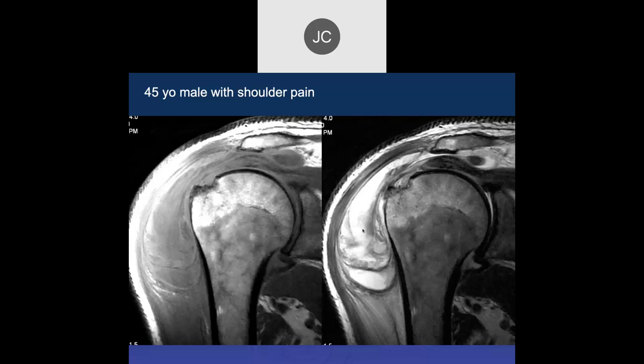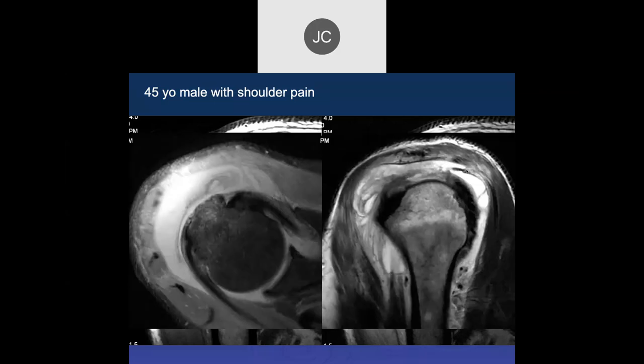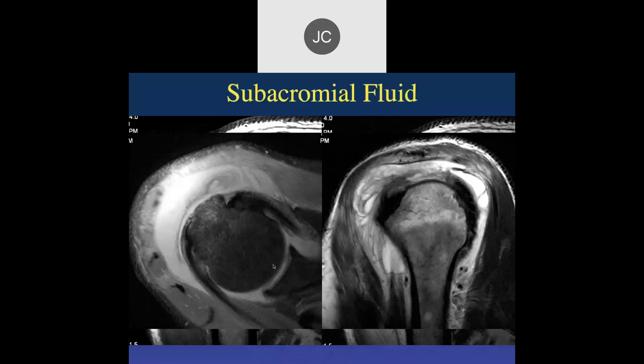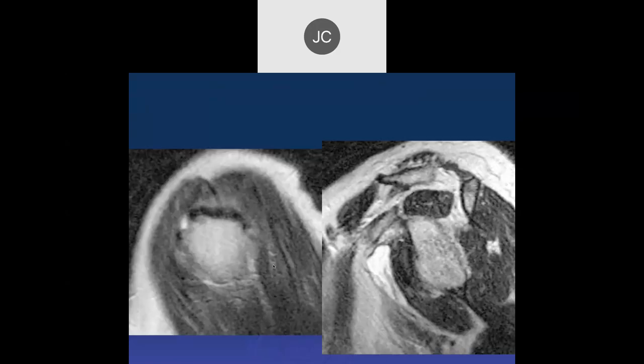It looks like acute synovitis. We usually don't see this kind of thickening, this kind of stranding, and these areas of low signal which might be acute hemorrhage. I'd be concerned about whether this got infected. We can see the supraspinatus full thickness tendon tear, and there's a lot of synovial thickening here. The glenohumeral joint space doesn't look too bad, but I'd be concerned about infection.